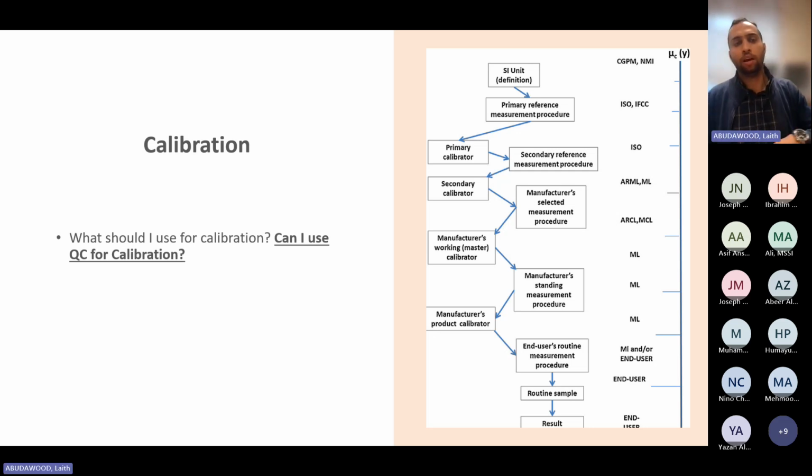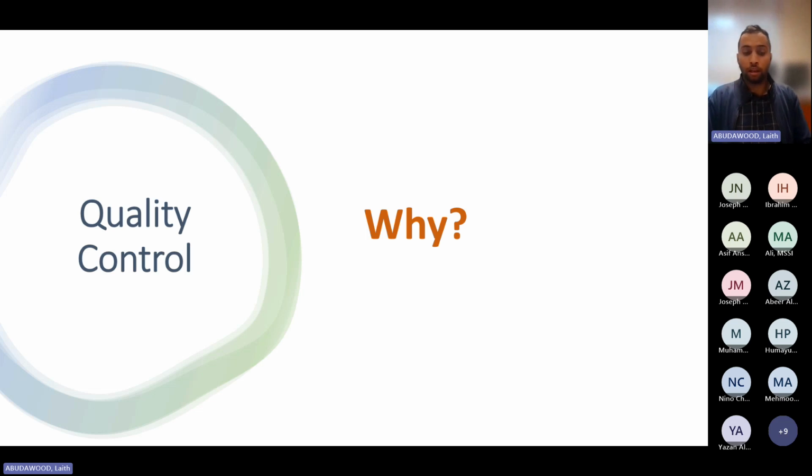So now I have done my calibration for the machine. How do I verify that I have actually done the calibration properly? That my calibrator, for example, is not expired or has a problem, was stored improperly, etc. Of course, the calibrator should be as accurate as possible. But again, you cannot rule out that maybe it was transported incorrectly, it was stored incorrectly, it was having problems.